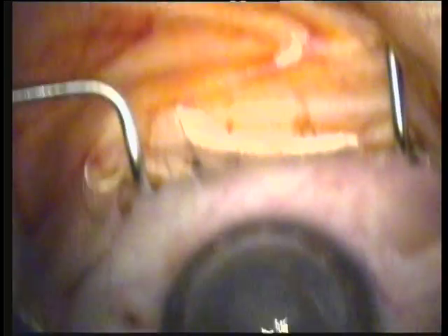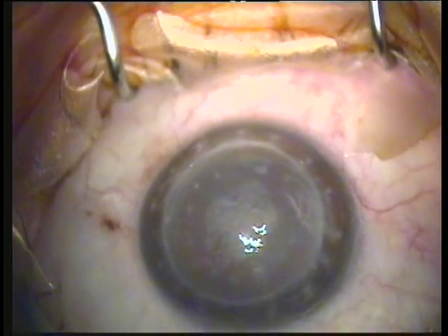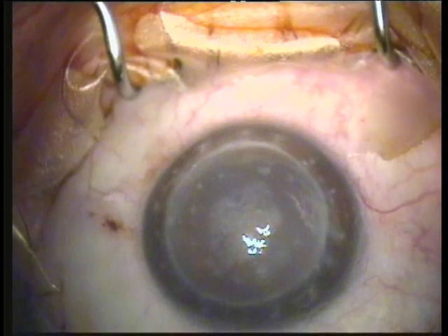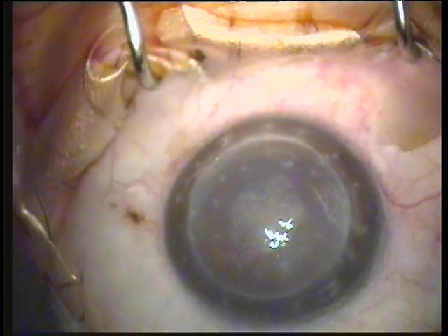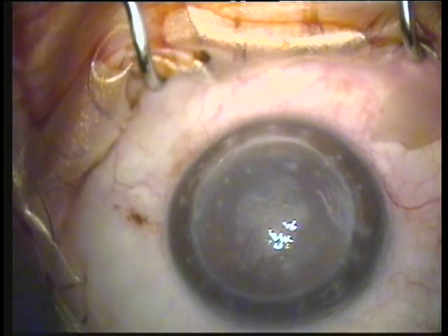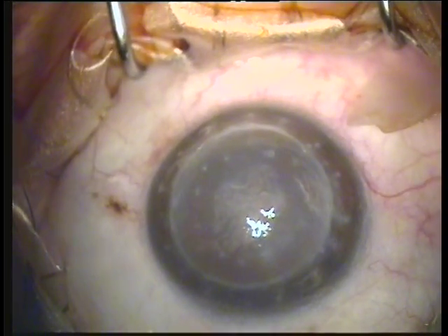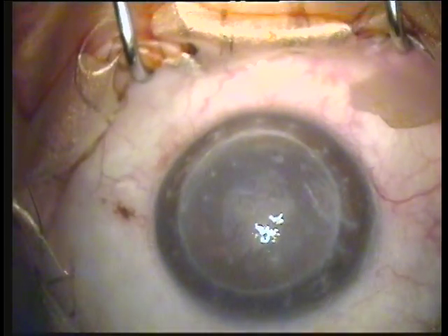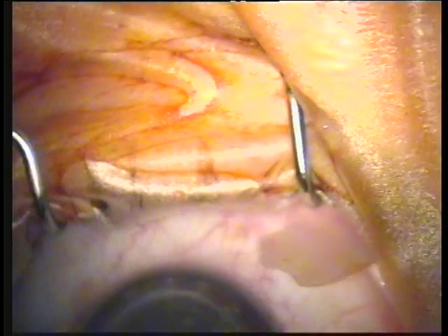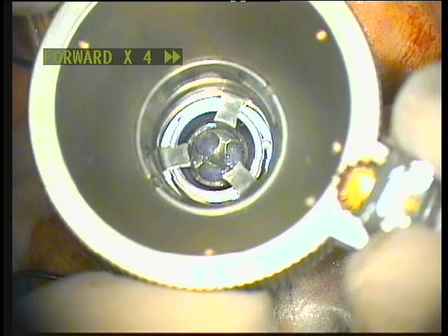You can see here the patient's eye — a failed cornea graft performed in the past. This is a large graft, about 8.5 millimeters in diameter. The patient has developed a very dense cataract, and we deemed it necessary not only to replace the cornea graft but to perform the cataract procedure as well.